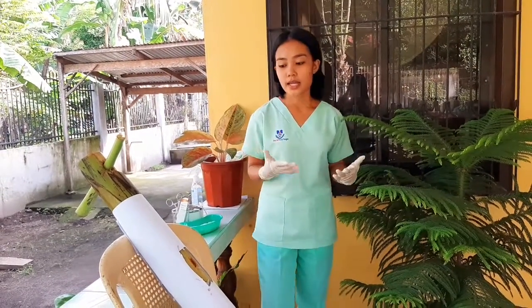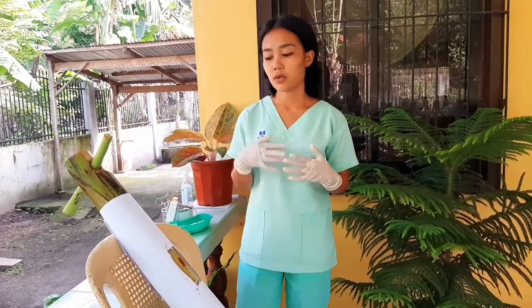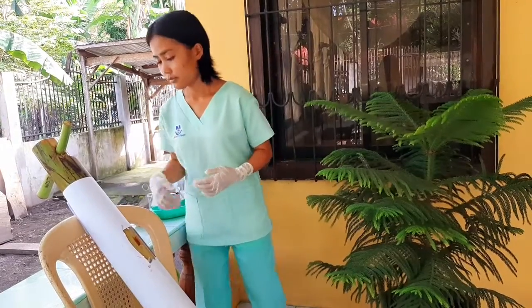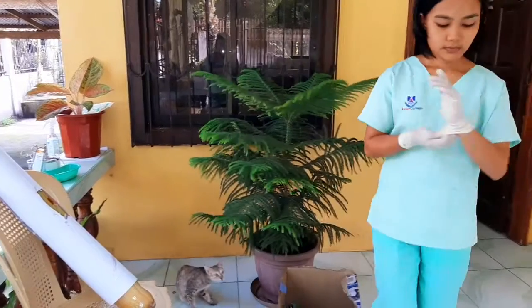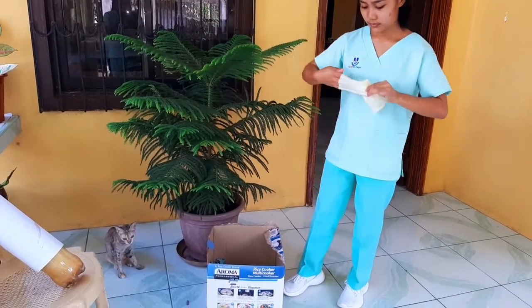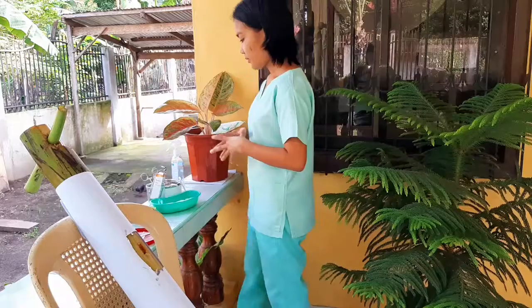Once the tape, bandage, or ties are removed, make sure to observe the characteristics and the condition of the wound. Then remove the soiled dressing into the waste receptacle. So, I have here the waste receptacle. Then dispose of the gloves inside out in the waste receptacle. After disposing of my clean gloves, I'm going to prepare all the sterile equipment or supplies.